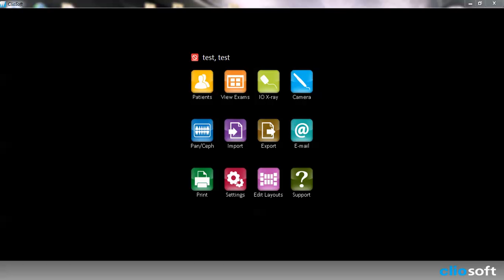Hi and welcome to ClioSoft video tutorial: View Exams. In this video we're going to talk about how to view exams of images that we have taken for our patients and how to use some of the tools that we have in the view exam. So let's go and get started.